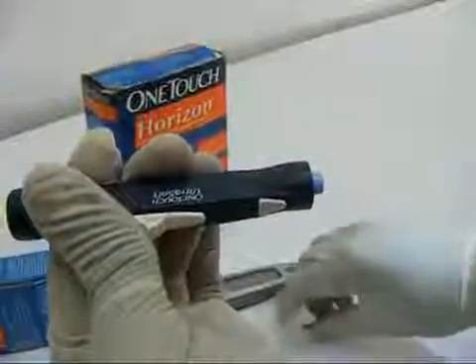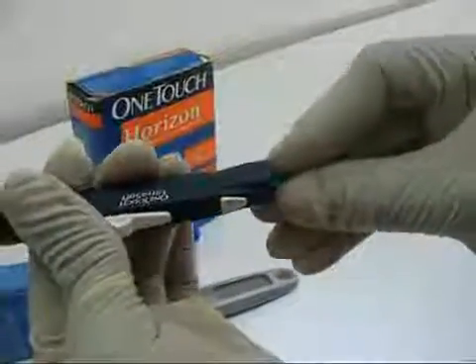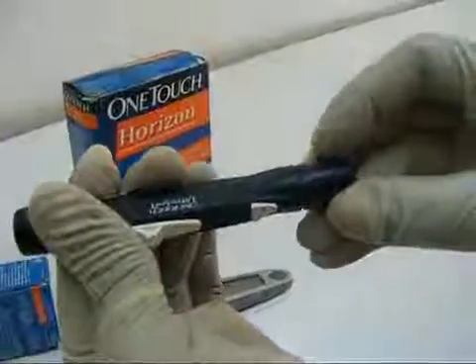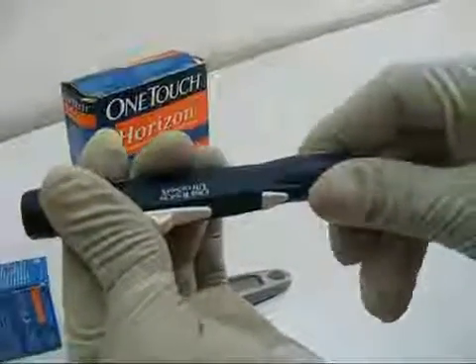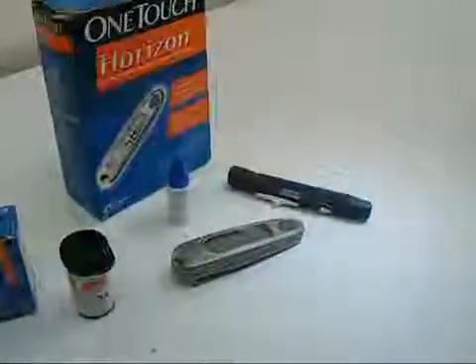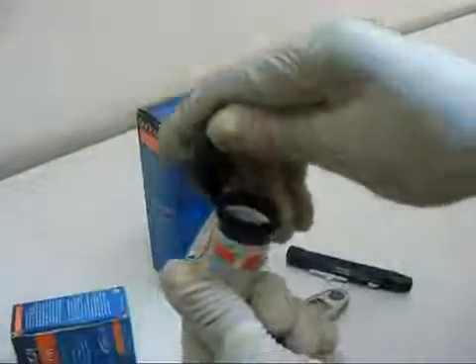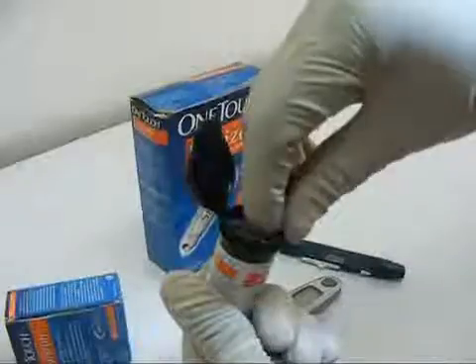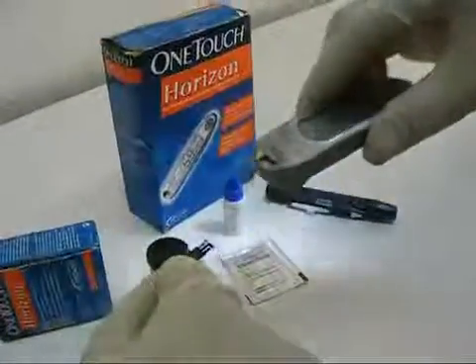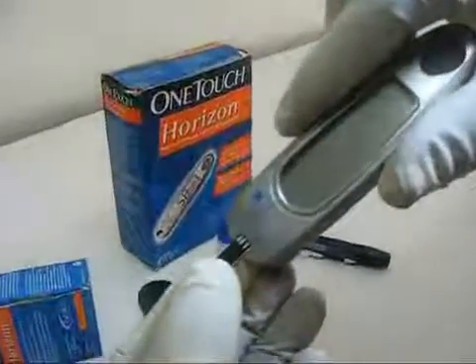The lancet is fixed onto the lancet holder and made ready for use. The glucose test strip is inserted into the meter. The electronic code registers and the meter is now ready for use.